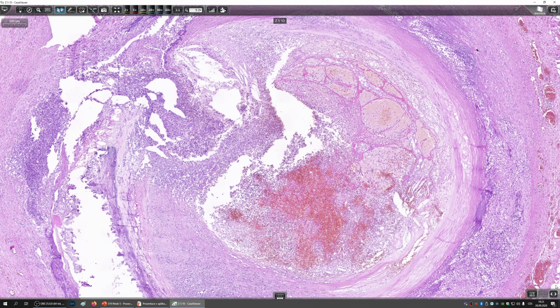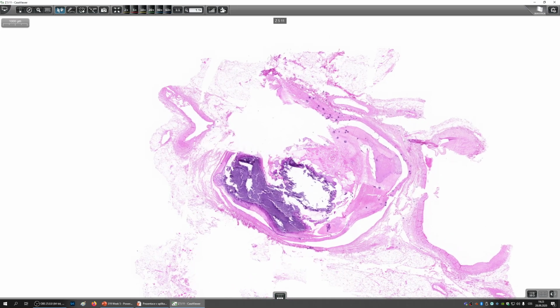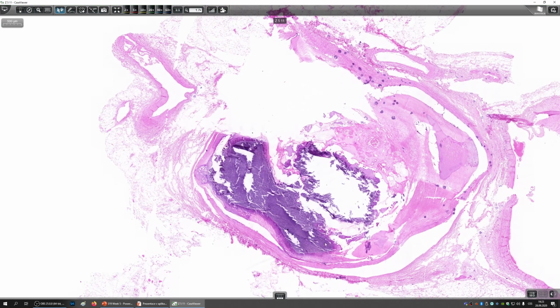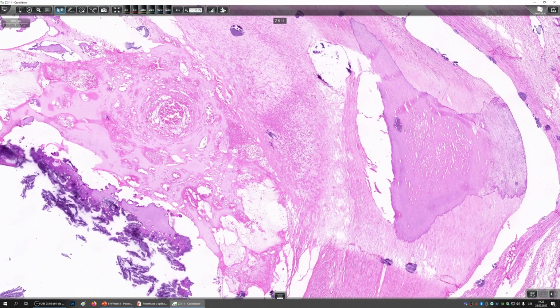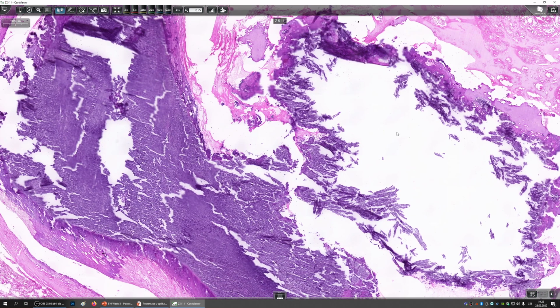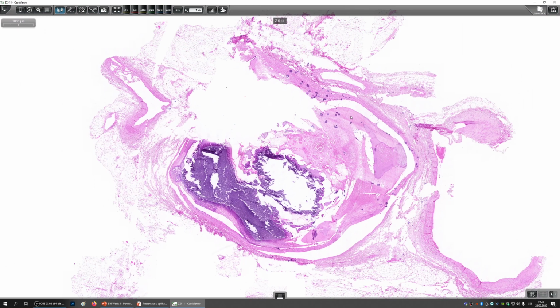Calcified atherosclerotic plaque. So this is a different type of plaque. In this case, the changes happened very gradually. Once again, it's all mangled because these are very hard to cut. So now I'm just outlining more or less how the blood vessel looked like. This is an artery, and here you see a massive plaque, which is mostly fibrous. Not a lot of fat here, and we see huge areas of calcification. You see here it has all calcified. So this plaque also has managed to plug up the entire lumen of the artery, just like the previous one.